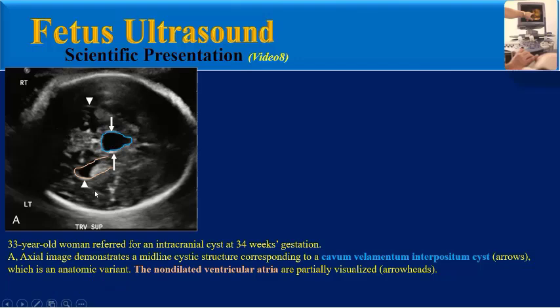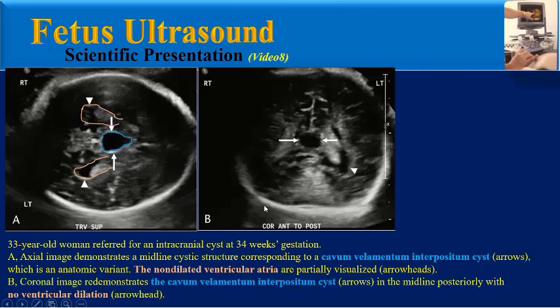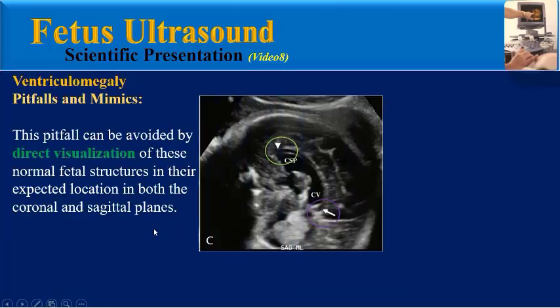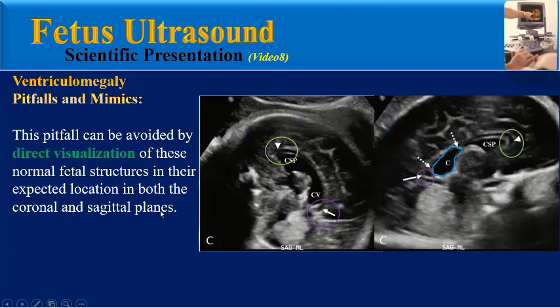The non-dilated ventricular atria are partially visualized. The coronal image demonstrates the cavum vellum interpositum cyst in the midline posteriorly with no ventricular dilation. The sagittal image reveals a normal corpus callosum from genu anteriorly to the splenium posteriorly, with the normal CSP anteriorly and the cavum vellum interpositum cyst posteriorly, outlined by thin walls. This pitfall can be avoided by direct visualization of these normal fetal structures in their expected location on both coronal and sagittal planes.